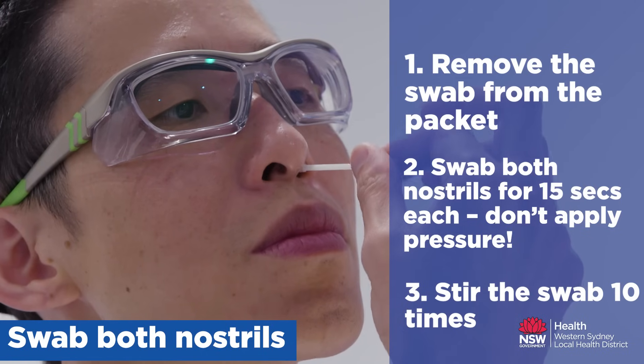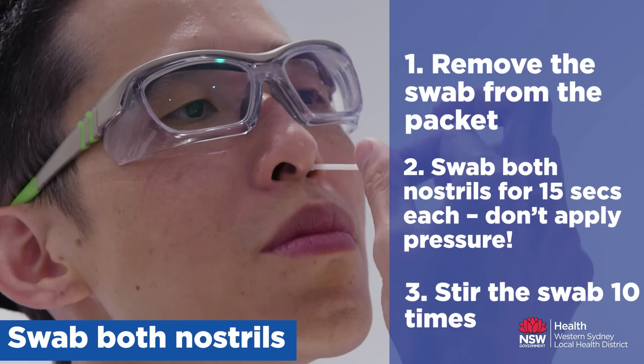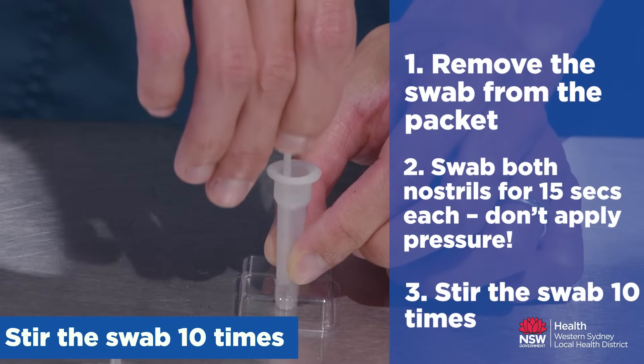Rotate the swab four times. Squeeze the tube at the bottom and hold it tight.